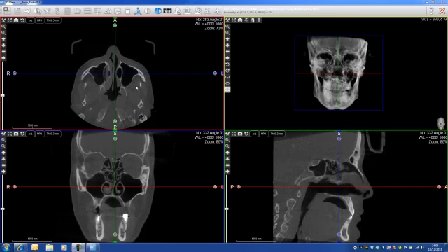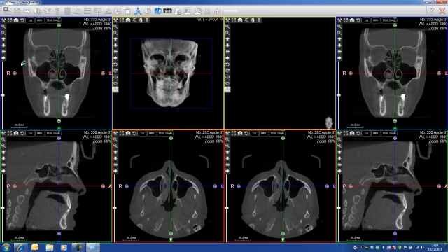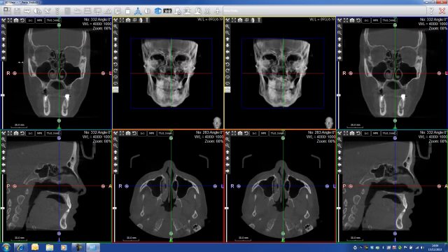Now let's see the TMJ module. This module is really specifically designed for TMJ analysis. I click on TMJ, and this is the view that I get.